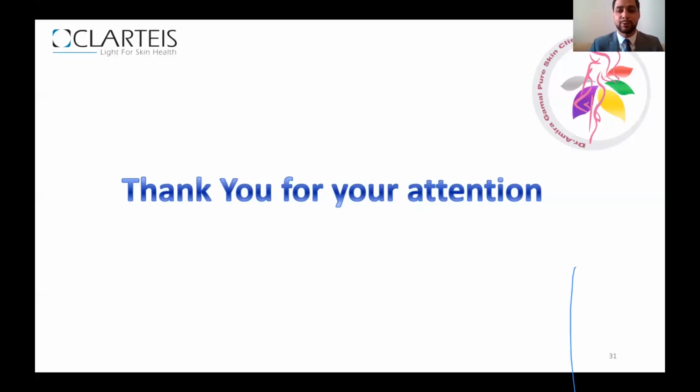Is it okay for a large area to use Exciplex? It doesn't take a lot of time for one session? No, it doesn't, because Exciplex has a very good and large spot size. Even for a large area, I don't have a session of more than 10 minutes. For example, to treat a vitiligo case on the chest, covering all the chest will take less than 5 minutes, because one shot of vitiligo is 4 to 5 seconds maximum. It depends on the area, how many shots we need to give. That's how we calculate the time of the session, but it's very fast.